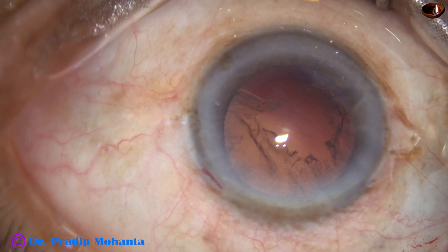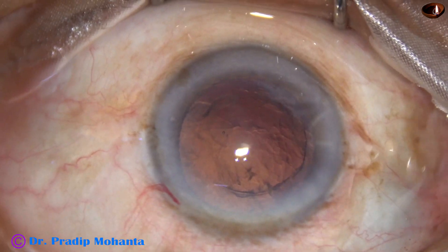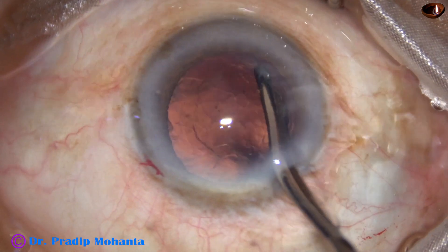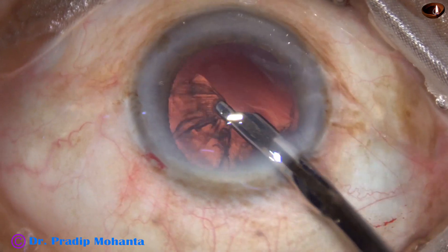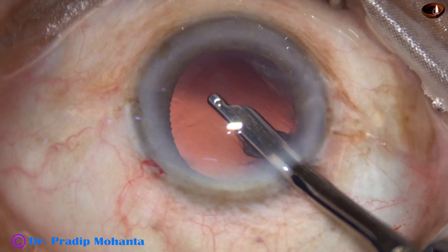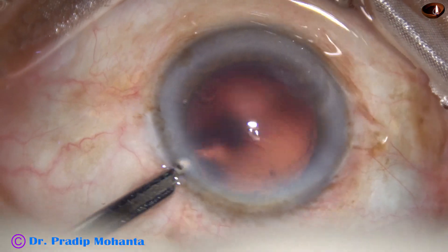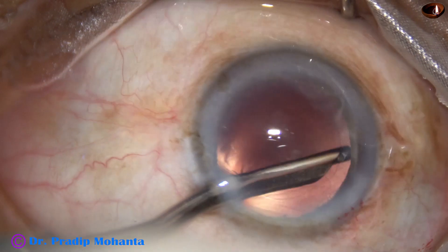There is some cortex. A little bit of viscoelastic is injected at this time so that the Simcoe cannula can be used safely. If there is no viscoelastic, the anterior chamber tends to collapse and the instrument may touch the corneal endothelium. By injecting some viscoelastic, it comes out gradually and the anterior chamber is maintained in a better way.